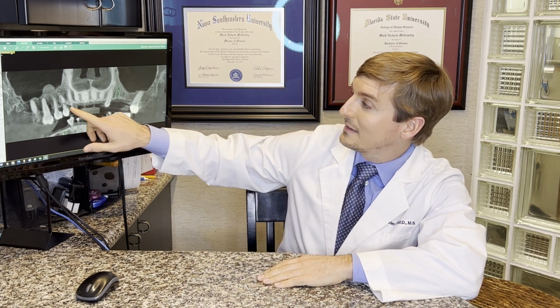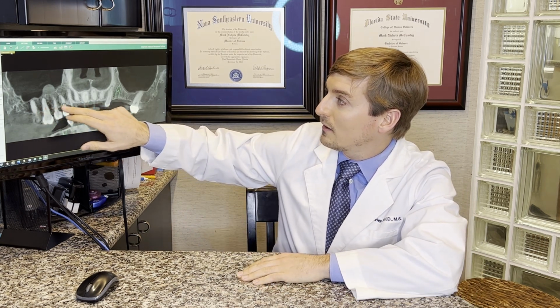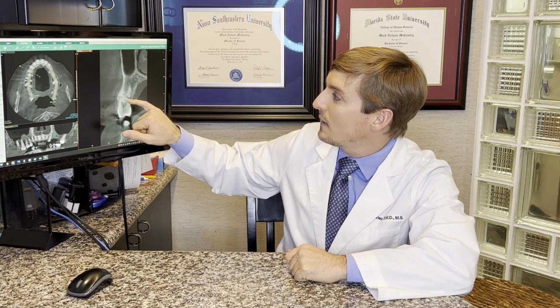Well, looking at this CT scan, you can actually see that the root is split. So, looking at normal roots right here, that root clearly has a split in it. So that was why she was getting that discomfort when she was biting, because that tooth had actually broken apart and was pushing back together, and it kept pinching the gums, pinching the ligament inside there. Looking at it from a different view, you can actually see that it is split right there. It's actually split right in that root, and that's what's causing that discomfort.